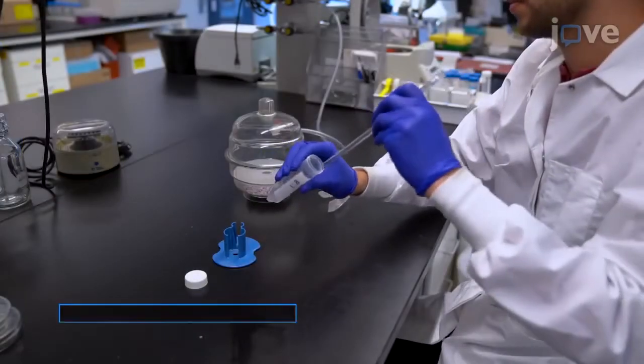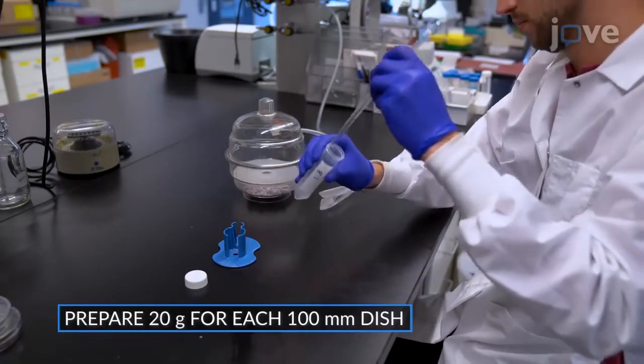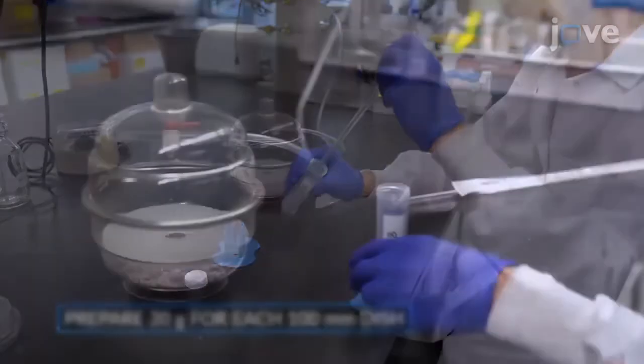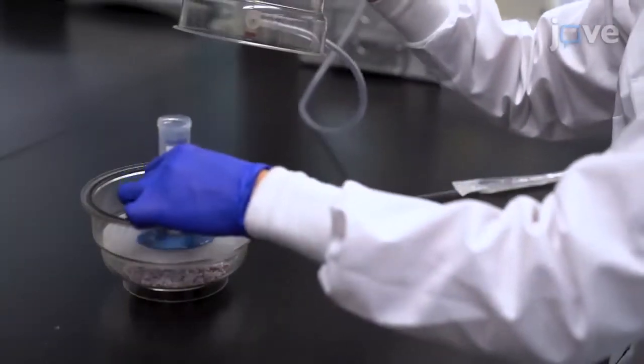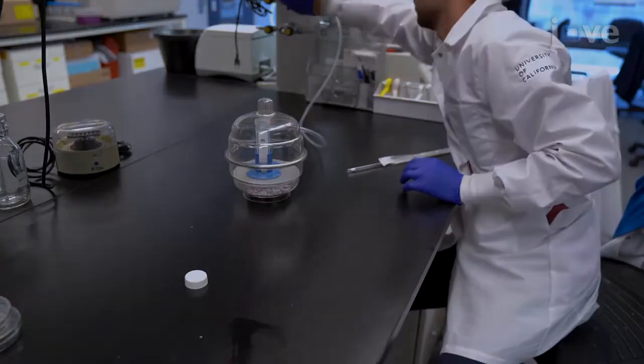After this, mix PDMS base with PDMS curing agent at a ratio of 8:1 by weight and mix thoroughly. Degas the mixture in a desiccator for 30 to 60 minutes or until all of the air bubbles are removed.